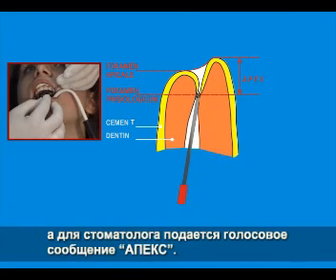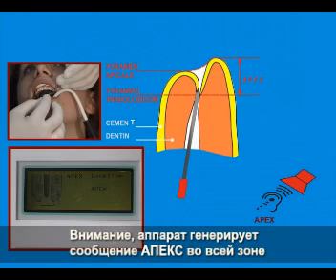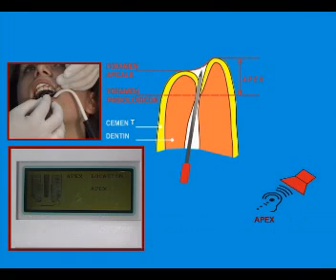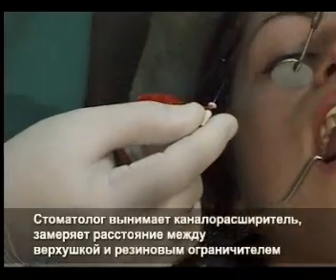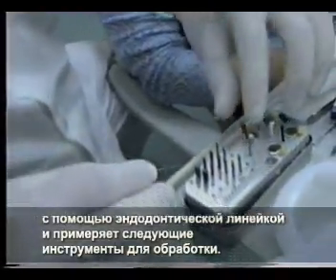The device generates a speech message to the dentist: "apex". Caution! The device generates the message "apex" in the entire zone between foramen physiologicum and foramen apicale, so it is the dentist who defines where to stop inserting the file. The dentist removes the file, measures the distance between the tip and the rubber stop with an endodontic ruler, and adjusts all instruments for the work to be done.